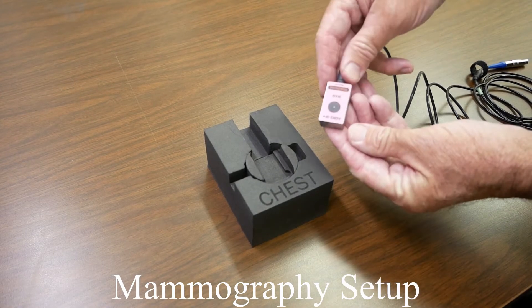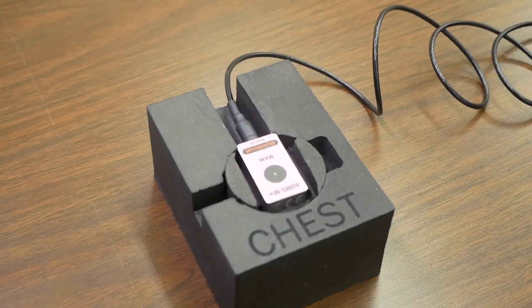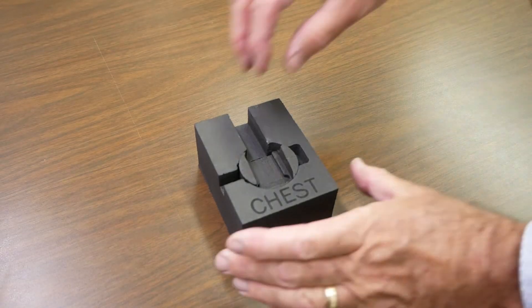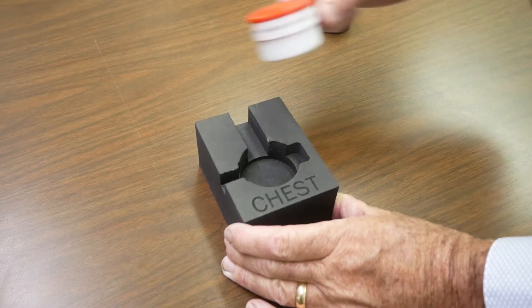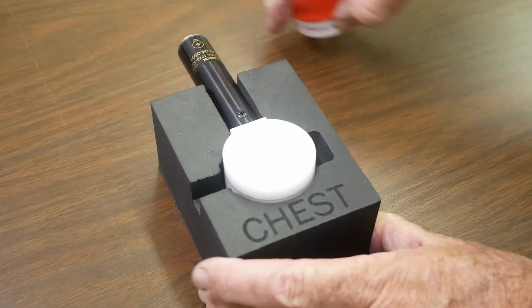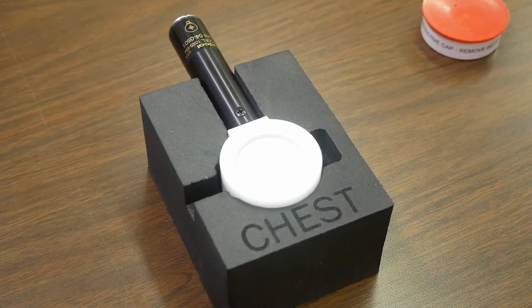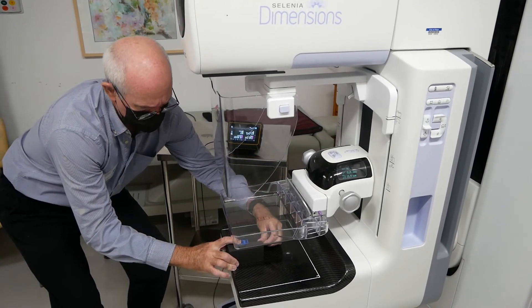RadCal provides a foam positioner block for mammography setup. Position the block on the detector chest wall edge then lower the compression paddle.